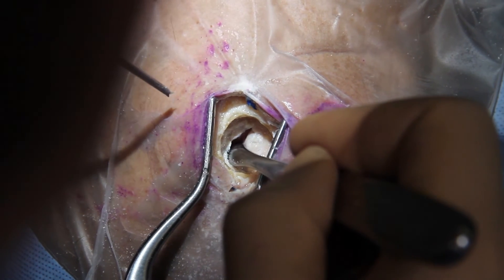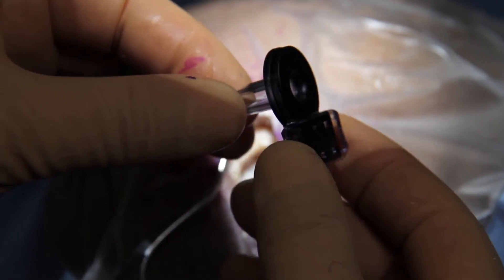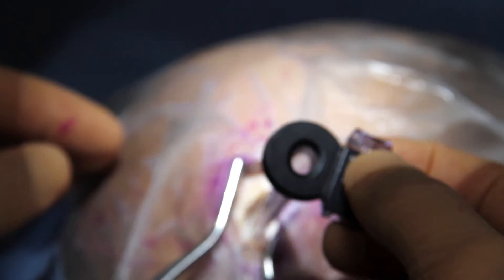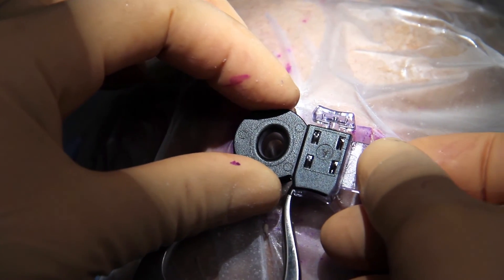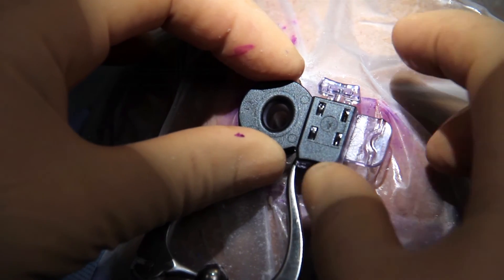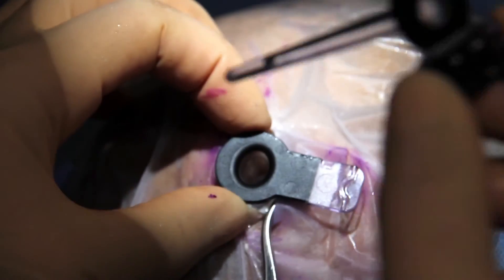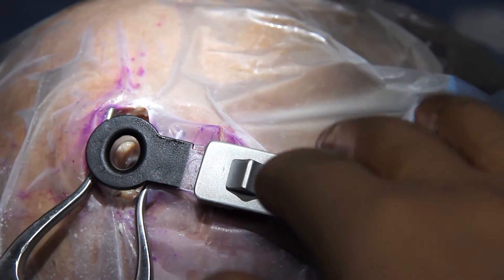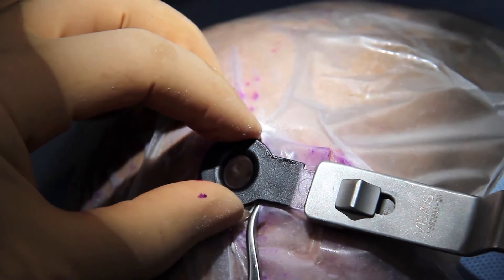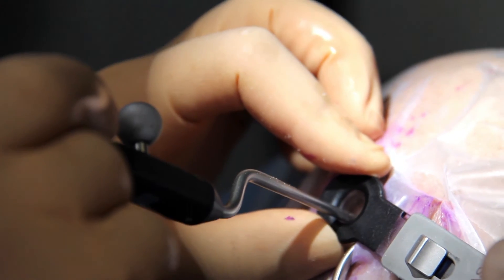A 1.5 cm craniotomy is usually enough, but sometimes a 2 cm craniotomy is needed in the presence of a bigger lesion. The introducer and working channel are inserted together into the brain according to the predefined trajectory. When the target is reached, the introducer is retracted and the system is locked to the extension arm, which can be locked either after or before insertion. The pointer is used again to confirm accuracy and positioning one more time.